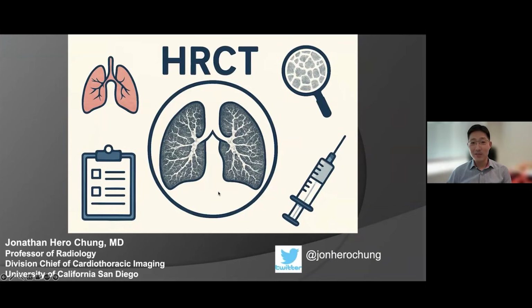We're going to be discussing some didactics on HRCT, but also more importantly, we're going to go through a ton of cases. And I think through those cases, you're going to learn quite a bit in addition to the didactics.